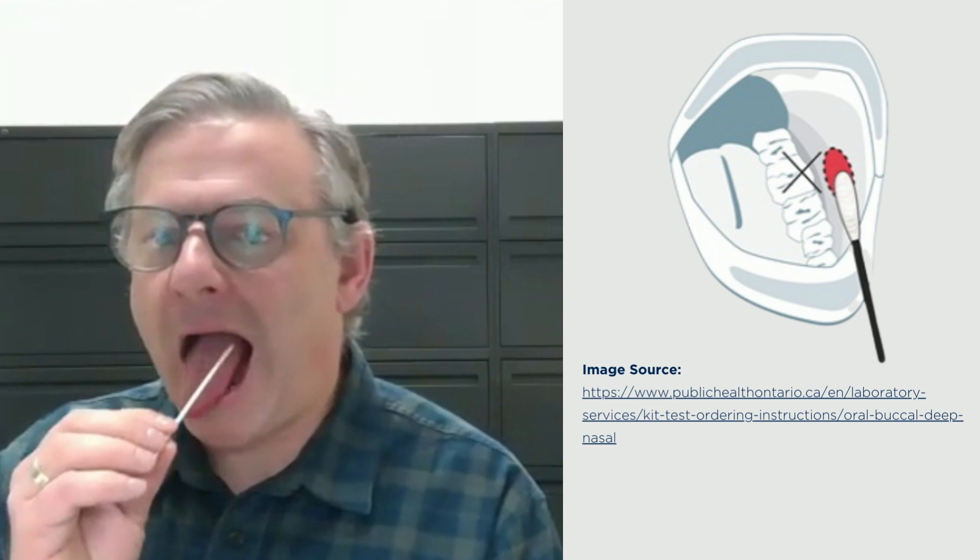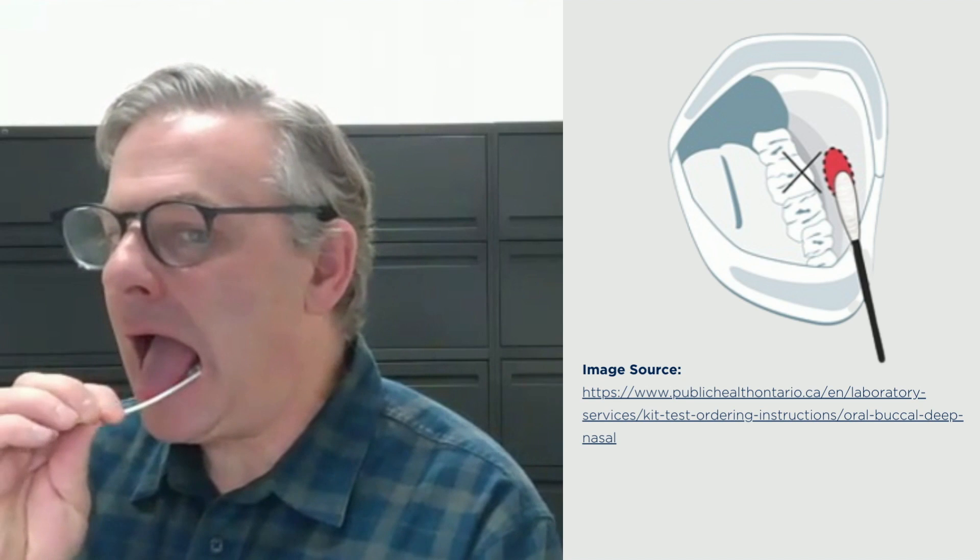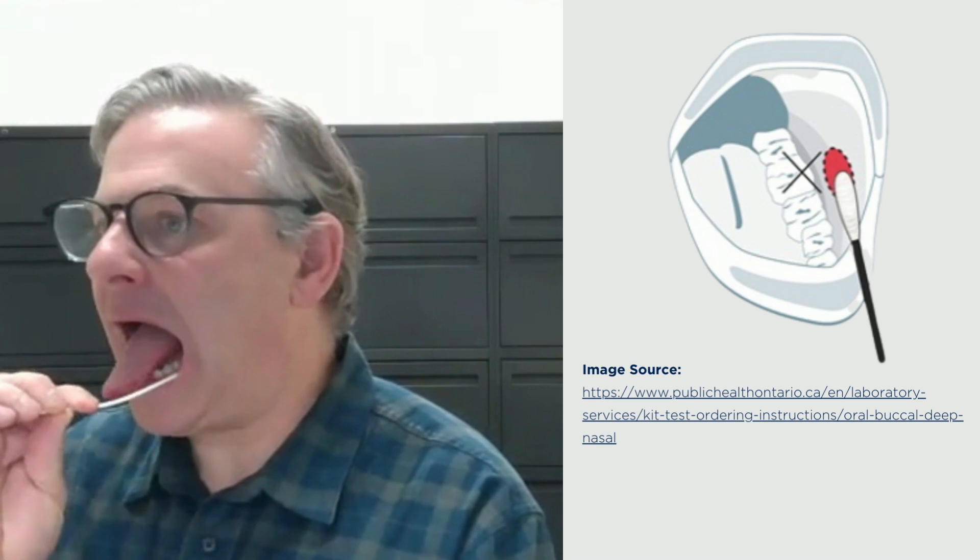Rub the inside of each cheek between the cheek and gums, rotating the swab for five seconds, avoiding your teeth. Don't forget to swab both cheeks.